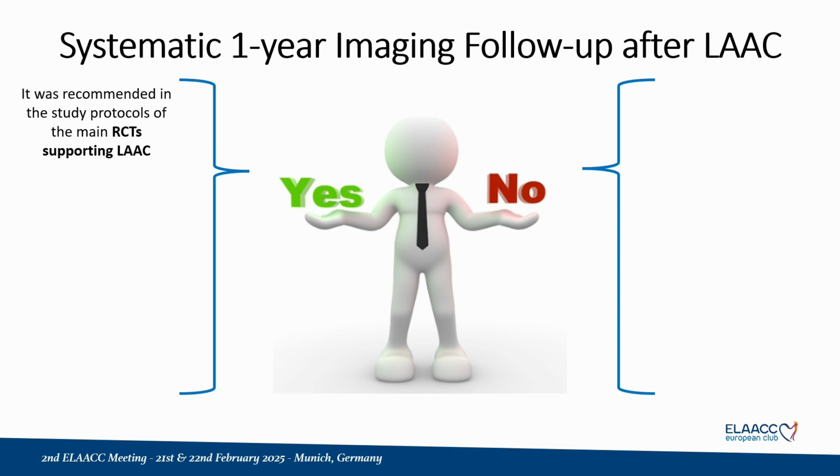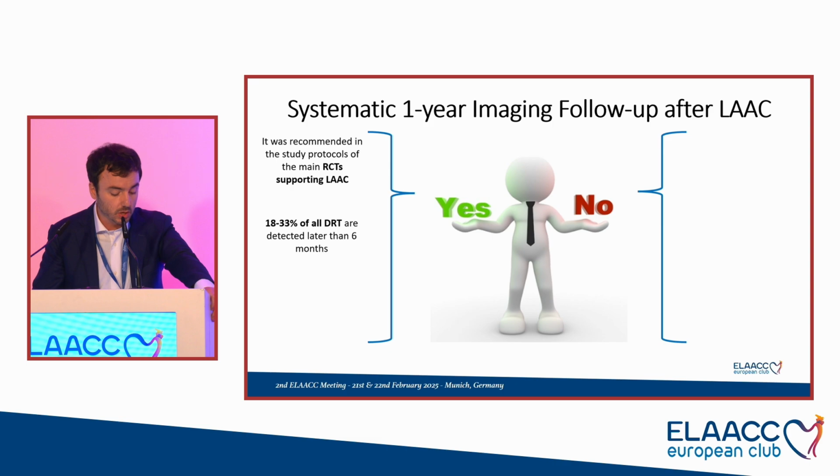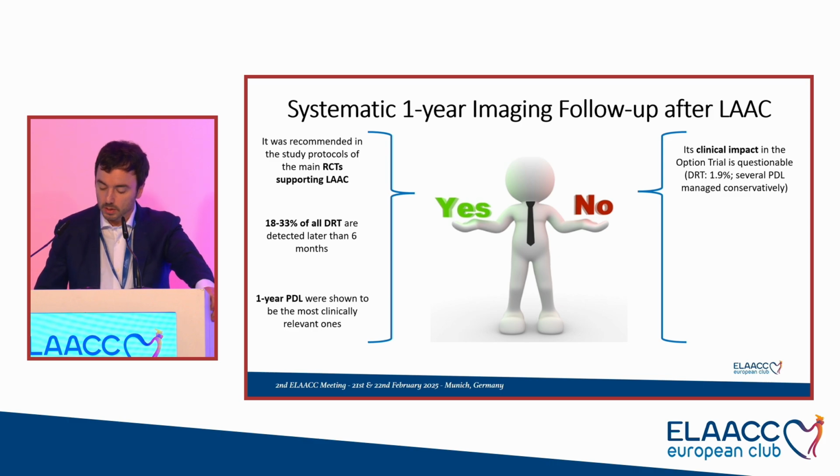Why yes? Because it was recommended in the study protocols of the main randomized clinical trials supporting LA closure, because one third of DRT seems to occur later than 6 months after procedure, and because 1-year PDL were shown to be the most clinically relevant ones.